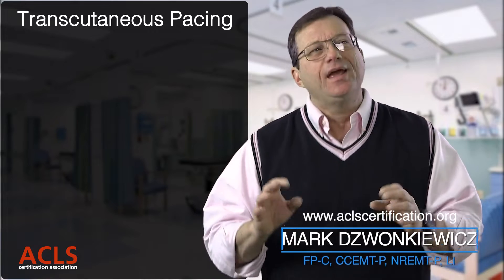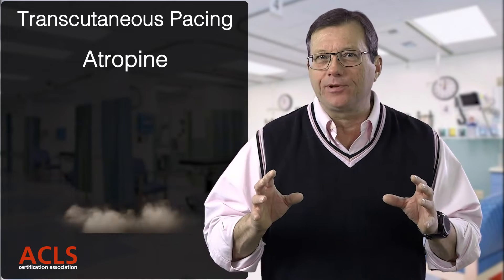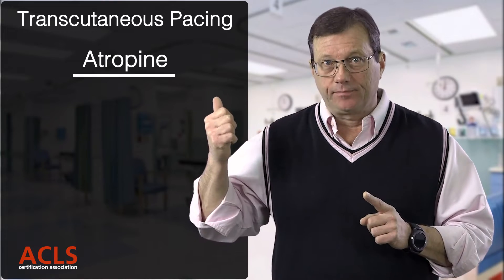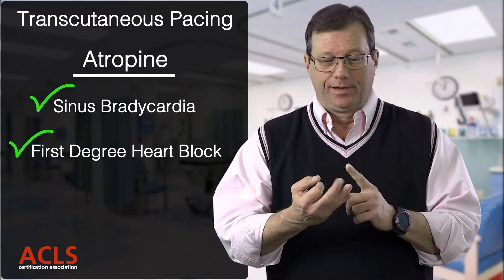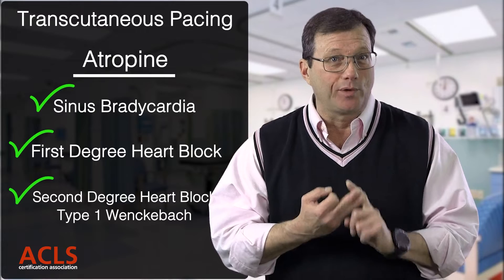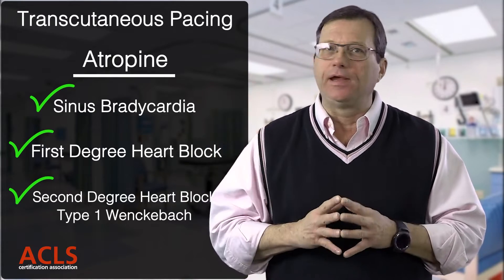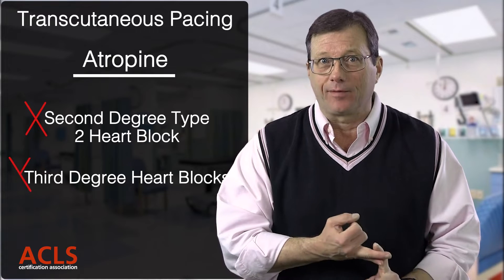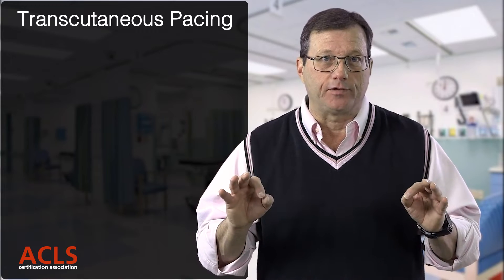In this video we're going to take a closer look at transcutaneous pacing. We use this for bradycardic patients where atropine was ineffective. Atropine can work on sinus bradycardia, first degree heart block, and even second degree type 1 (Wenckebach), but once the block gets below that level, atropine is most likely not going to be effective. For second degree type 2 and third degree heart blocks, you want to get out your pacer quickly.